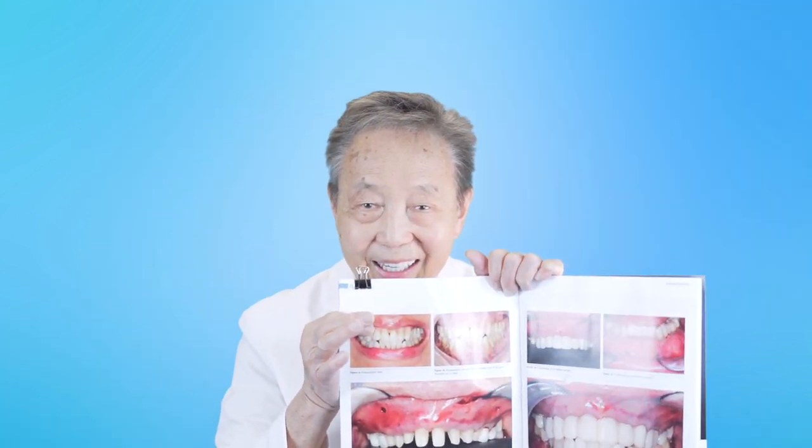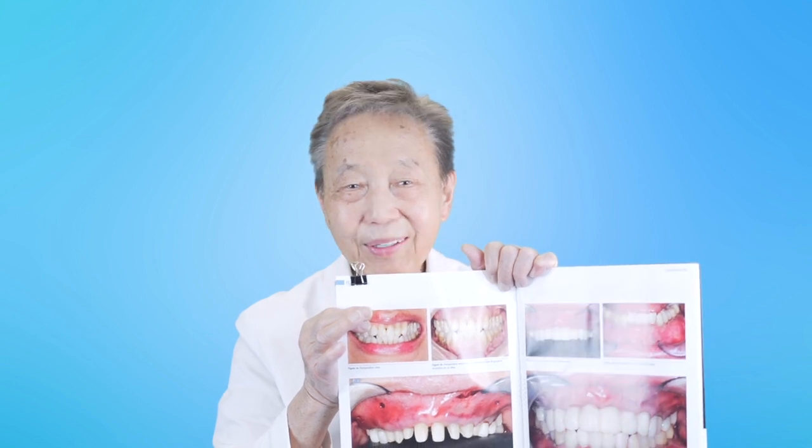This was all done in one appointment, and she had hardly any pain the next day — she took only a couple doses of Tylenol with Advil. This is what she looked like when she left. We then monitored her and made changes on her provisionals or prototypes over the course of the next six to nine months.